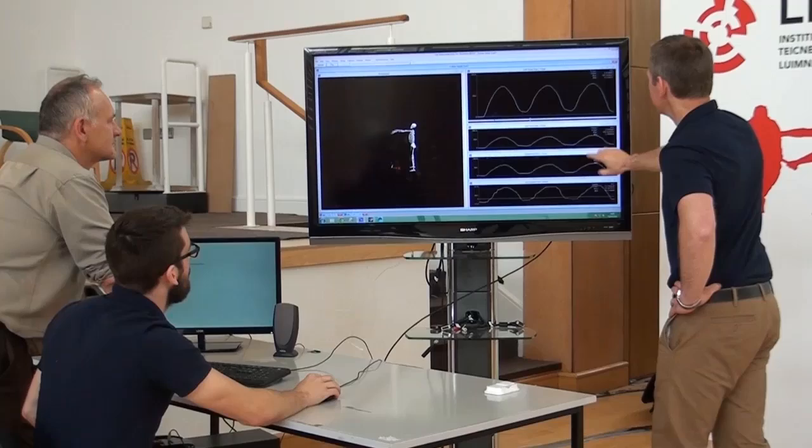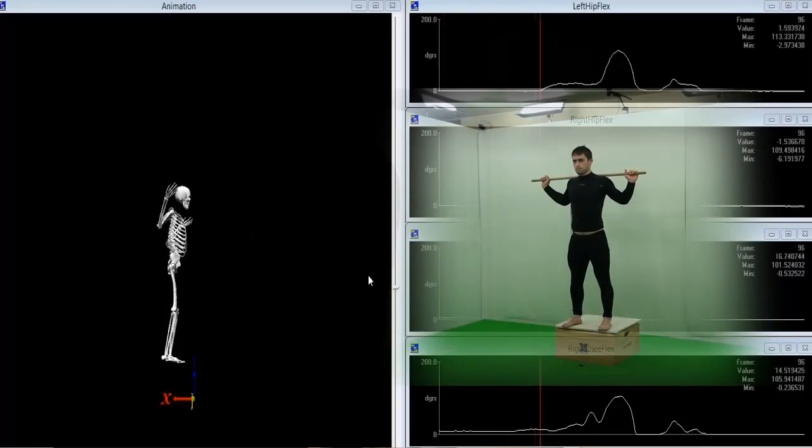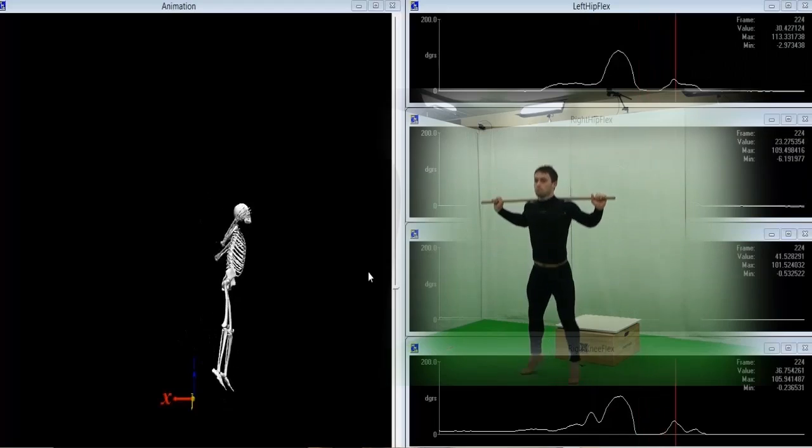The 3D system that we have here behind us essentially and simply can analyse the quality of movement with such precision that all types of motion and movement, whether jumping, moving, standing, bending, twisting, can all be actually quantified.